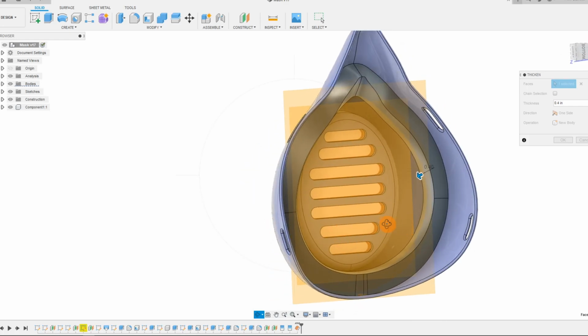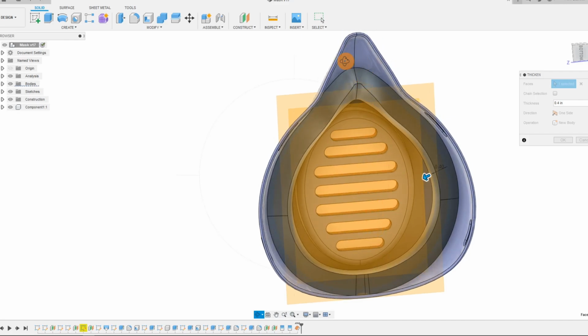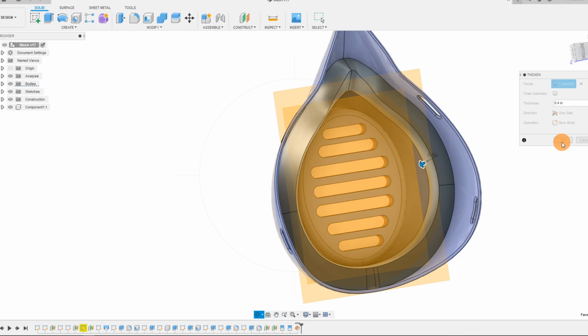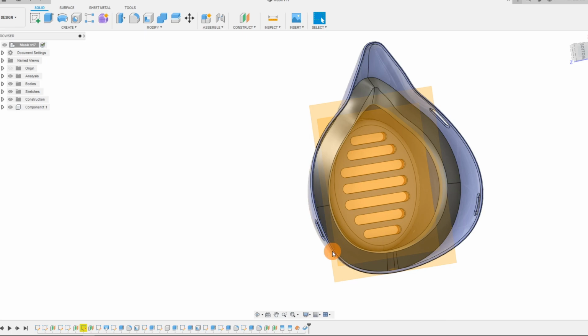And in real life, this would be single-sided adhesive, which would attach to this inner cup. So I'm just going to leave it at this. I think that this dimension works for what we need. So that dimension has been created.